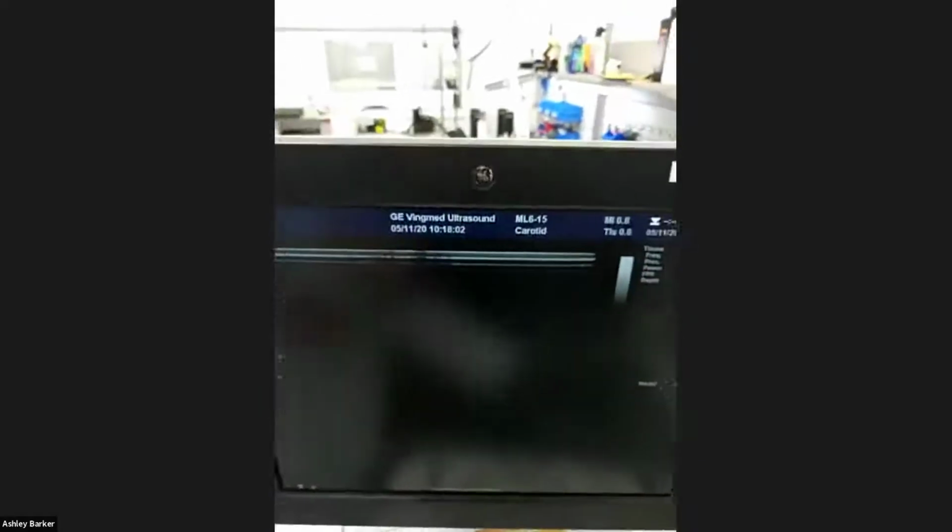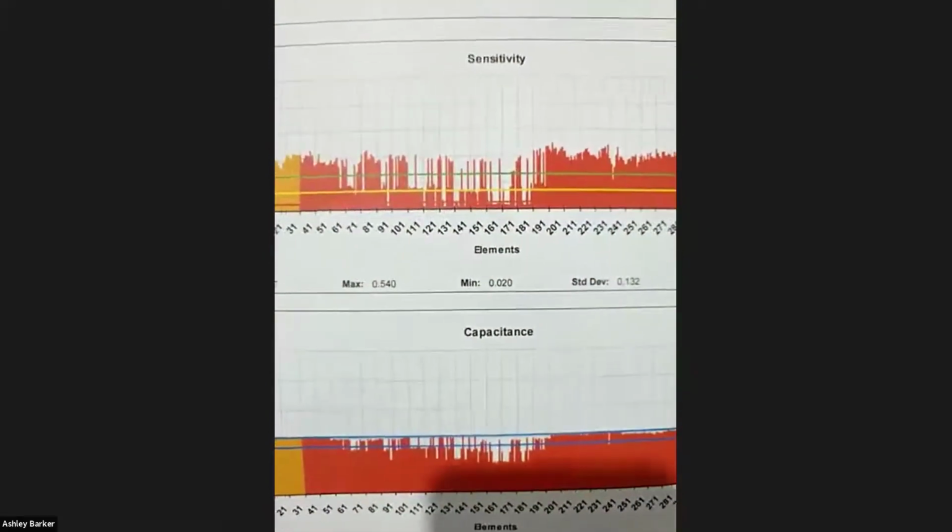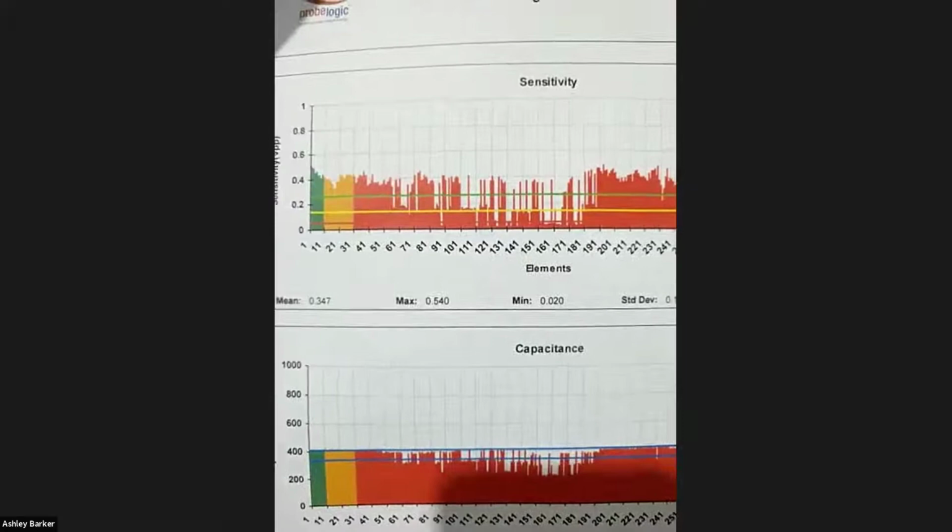And the amount of times we go out to clinics and there's massive dropout regions and no one's dealt with it. So I think people just need to be a little bit mindful and start looking for that. Now, you can see what that looks like. You can see there's a fair bit out there. If we actually look at the acoustic test, there are a lot of elements out in that probe.